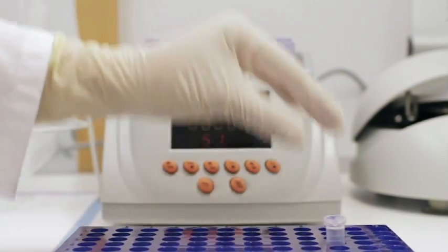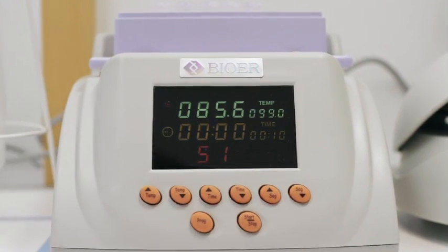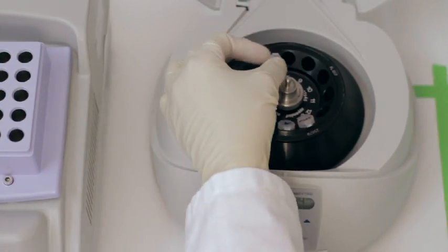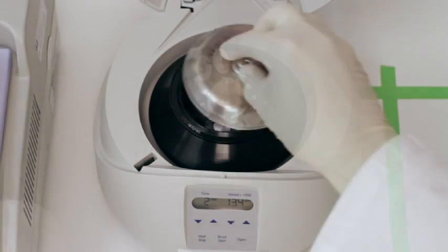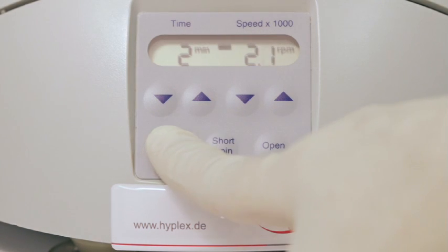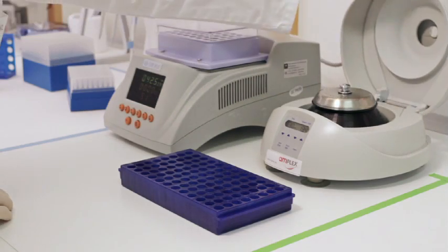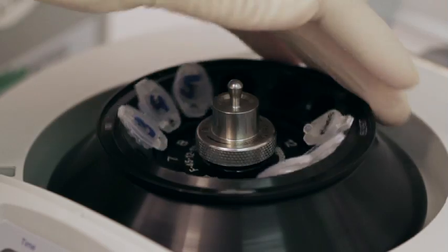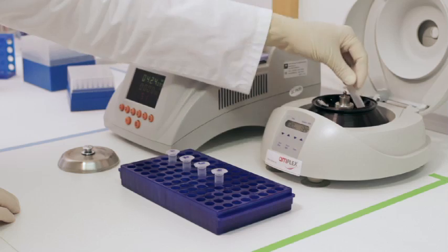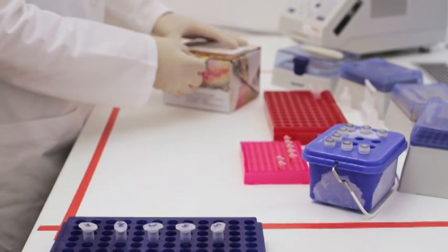To clean the sample, centrifuge for two minutes at approximately 10,000 G. The resulting supernatant can be used directly as the sample for the PCR reaction.